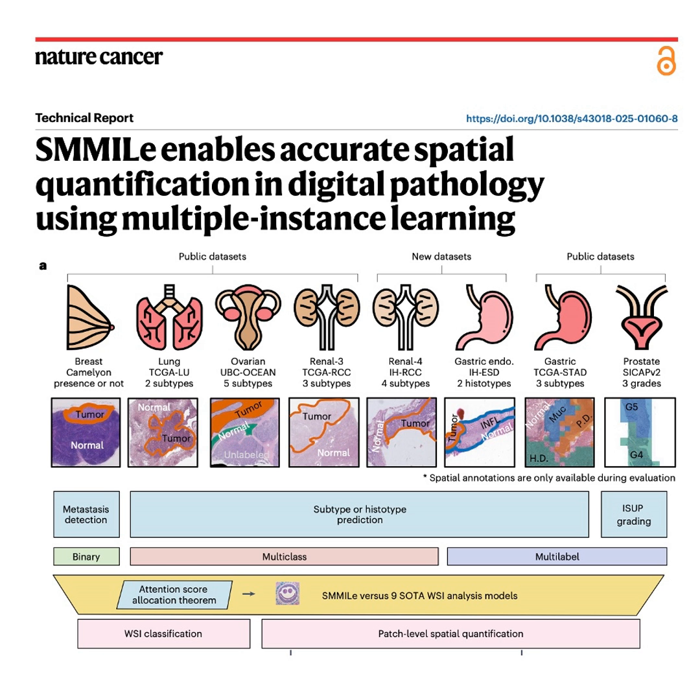Wait, what makes a superpatch different from just a regular square patch? That's a key detail. A superpatch groups pixels based on their actual biological similarities, not just geometric lines. Oh, wow. Yeah, it creates organic neighborhoods. Then SMMILe applies a convolutional layer over these neighborhoods, expanding the local receptive field. Exactly. Because without that convolution, the AI is essentially staring at a single house through a telescope. It has no idea if the house is in a suburb or an industrial zone. By adding that layer, the AI can see the entire neighborhood, giving it crucial biological context. Which is absolutely necessary for the next module.